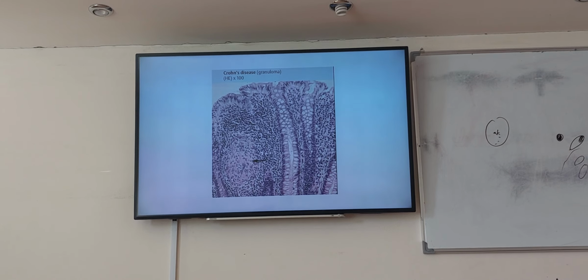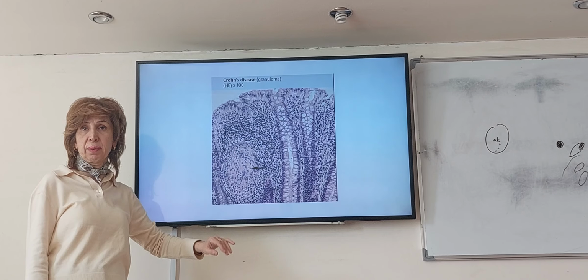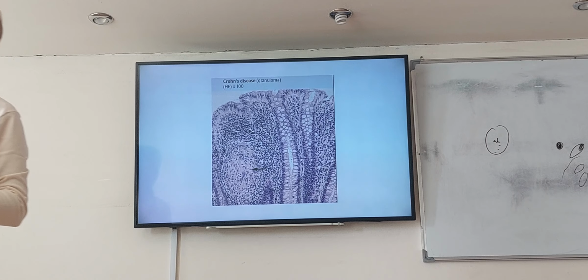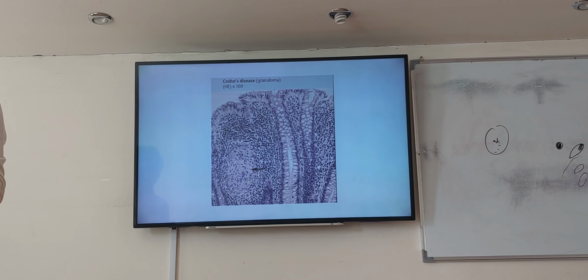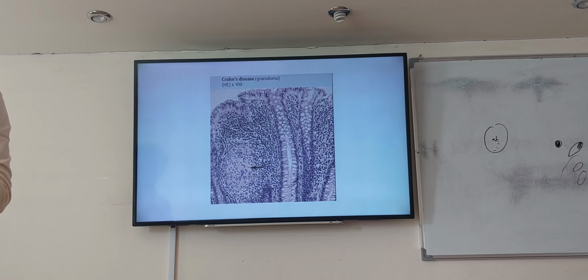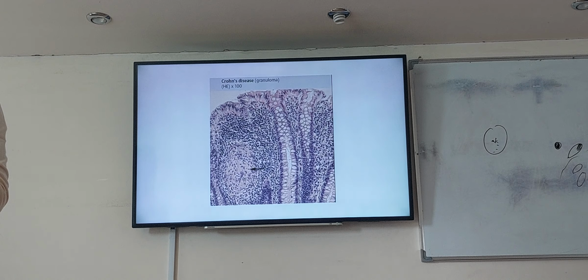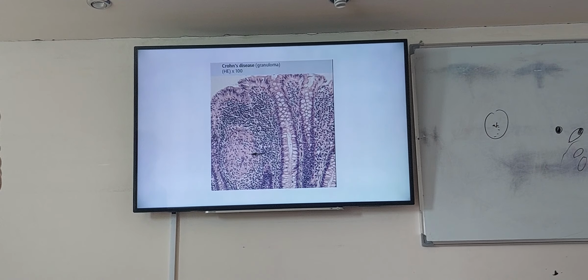This is Crohn's disease. Again, sarcoidal granuloma. This is again lamina propria. It is non-caseating granuloma. Next year, in internal medicine, they ask you what is Crohn. It is chronic inflammation with non-caseating granulomas. Okay? It's a very serious disease. You will study about it a lot in internal medicine and in surgery. But always remember, Crohn has non-caseating granuloma. It is a chronic disease.